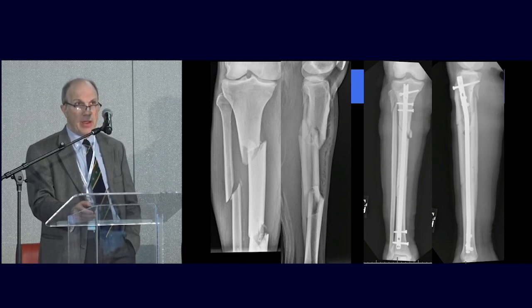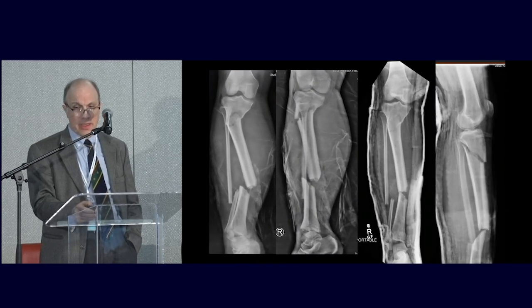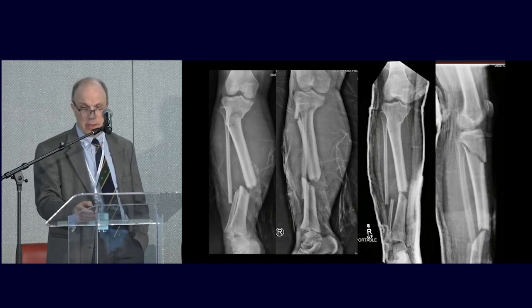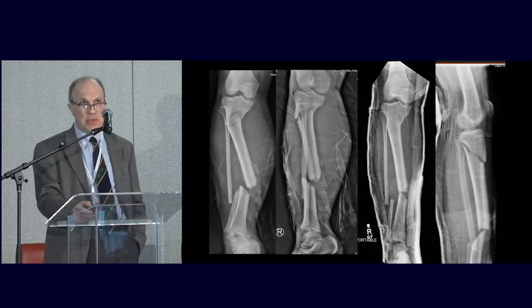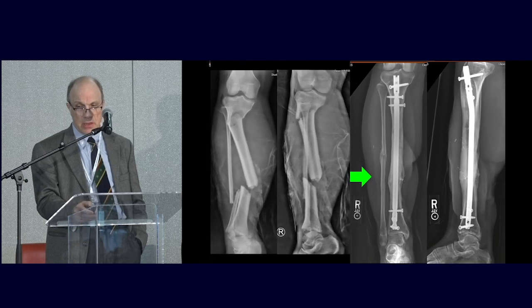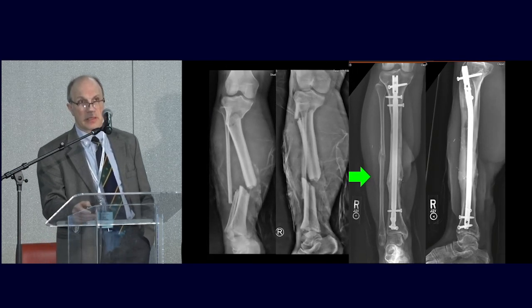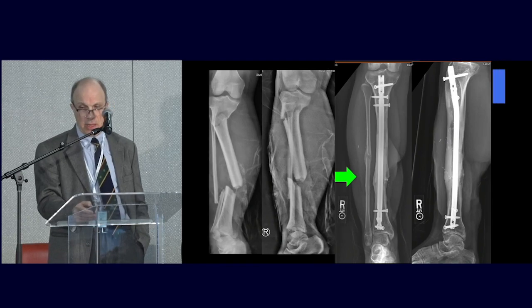I think holding your reduction throughout the case is important. And in addition to the segmental case that I showed earlier, there's a proximal metaphyseal fracture, a very proximal fracture, which is a little harder to control. Again, you can do that with this traveling traction setup and get a good alignment and get them to heal in good alignment.